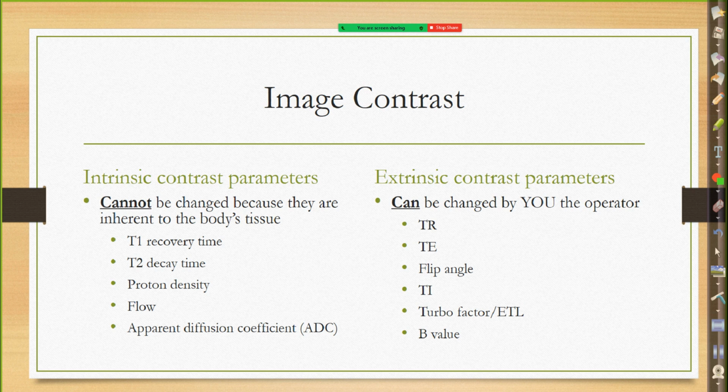If you know that the patient has a prosthetic, you wouldn't use AEC on that one. Good. So setting our techniques manually, so kVp and mAs, focal spot size, AEC, the cells that we're selecting. All those things we can select on our console would be considered extrinsic parameters in X-ray.